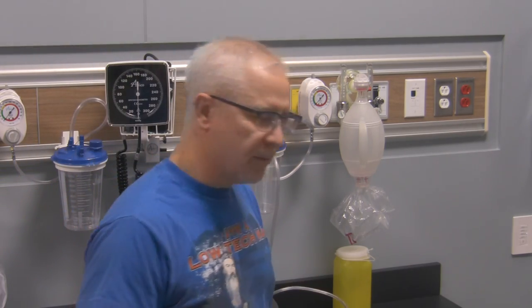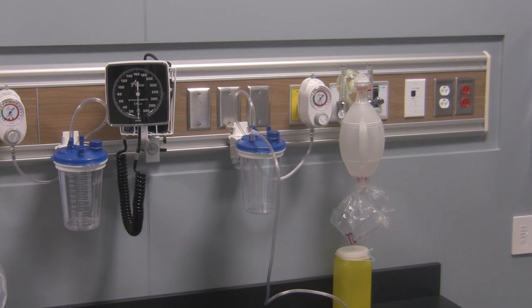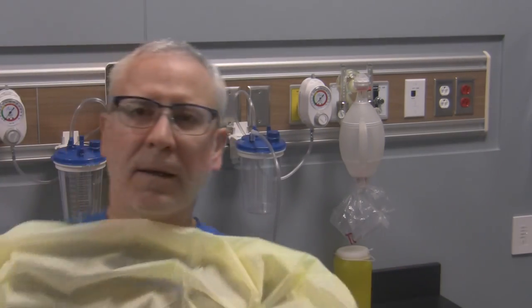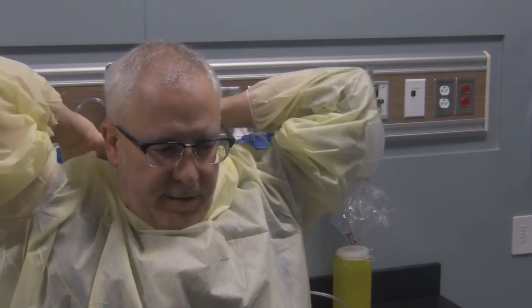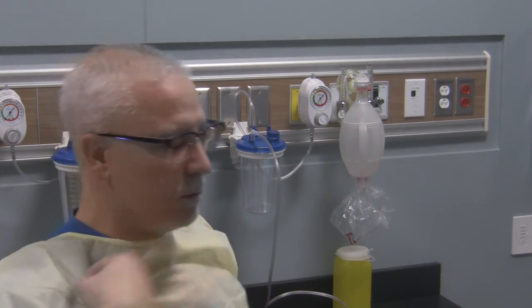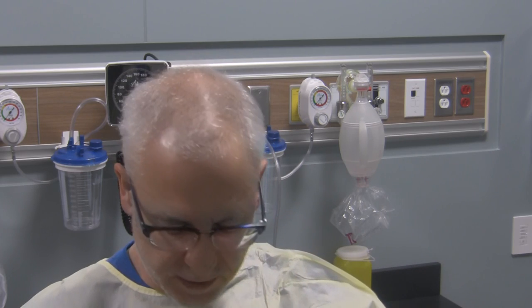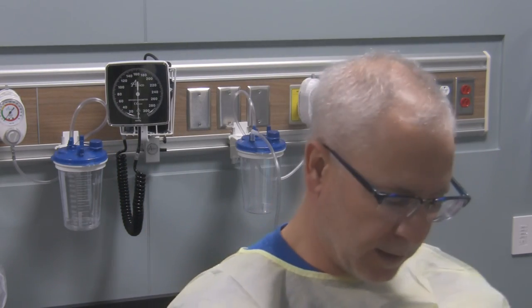To start the procedure, first we're going to don our PPE. I'm going to put this gown on — I'm not going to tie it up, just put it on as a protective mechanism. If you needed a mask, put one on now. Since I'm doing clean technique, I'm simply going to put on clean gloves.